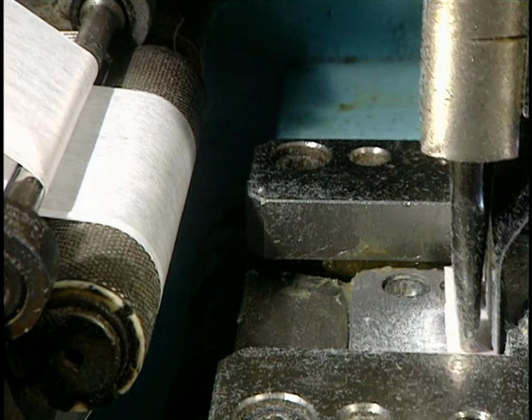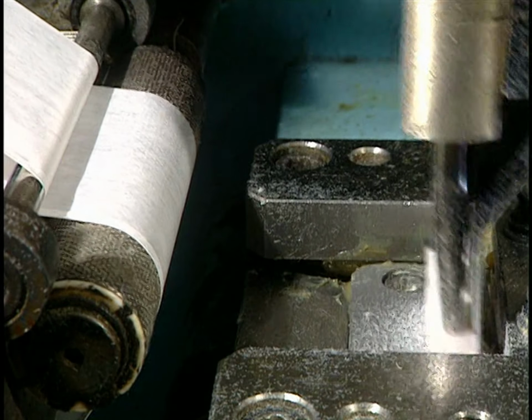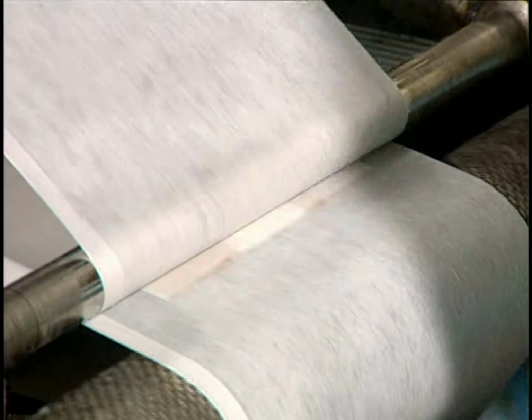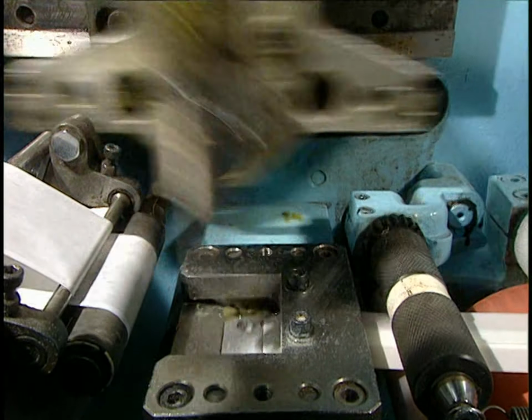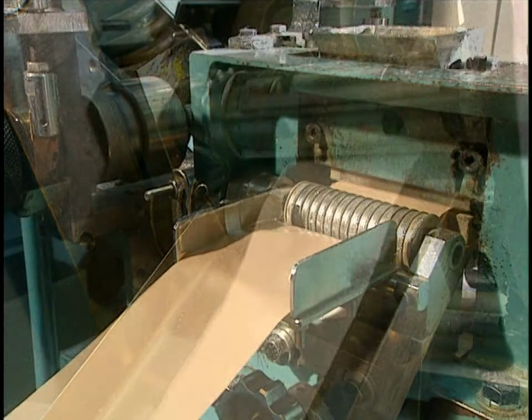This done, the bandage is drawn by suction with a robotic arm and placed between 2 wrapping papers. In slow motion, we see the wrapping action better. This machine is much faster than the eye. At full speed, it can wrap 300 bandages a minute. The bandages exit the machine, perfectly wrapped.